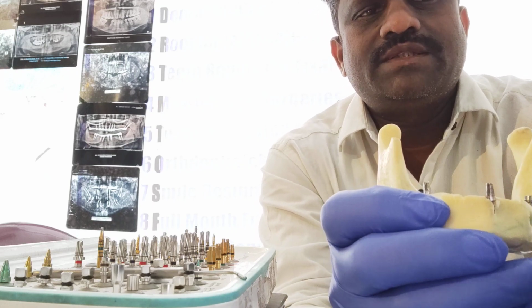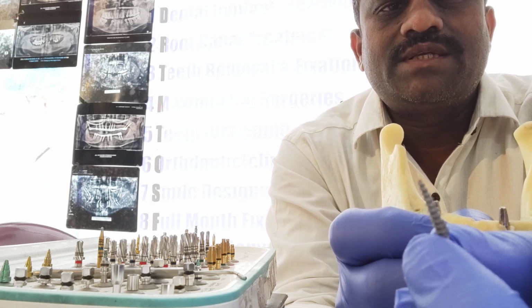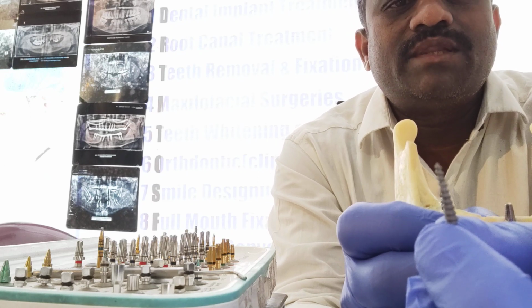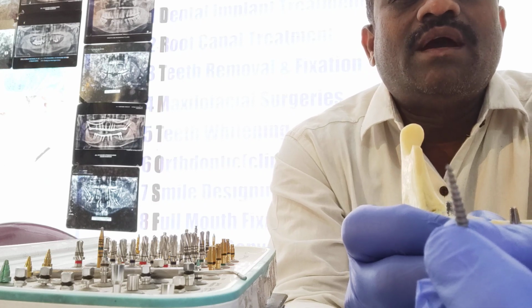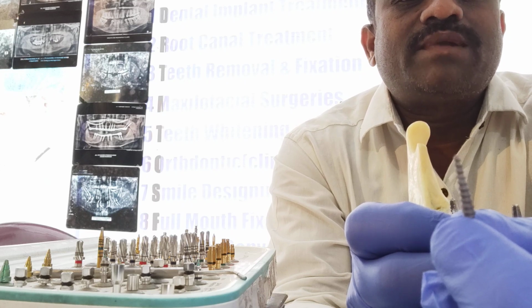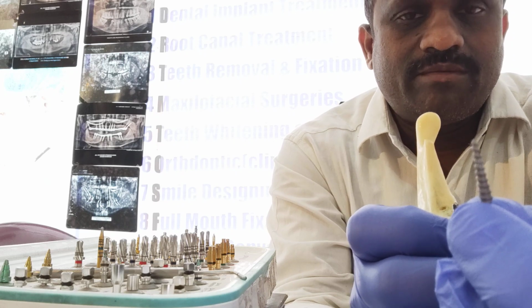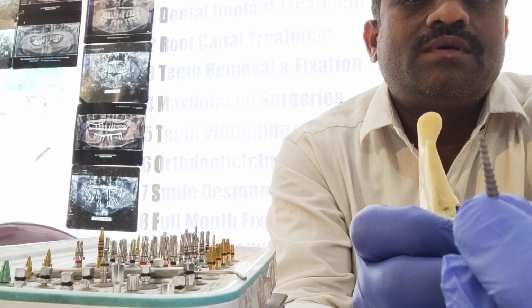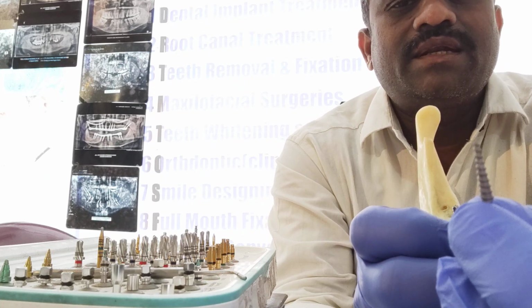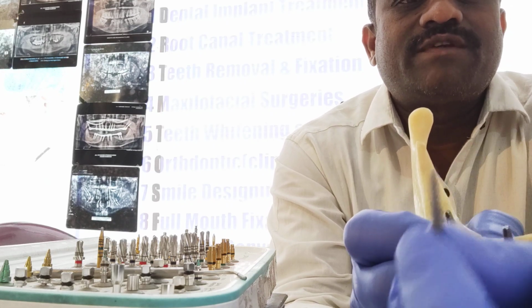So another one I have is a rough surface implant. You can have a look. This is a rough surface implant. Usually I prefer placing these rough surface smaller diameter implants of length 18 to 20 mm in the anterior mandible as well as in the maxillary anteriors, depending upon the type of bone. Usually this rough surface implant will be surface treated, and it will have an anodized surface. So the first step will be osteomodulation or osteofixation. Then in the secondary intention, osseointegration will happen in both BCS as well as rough surface implants.